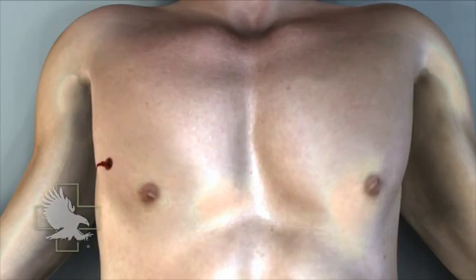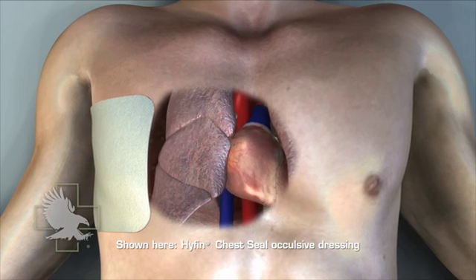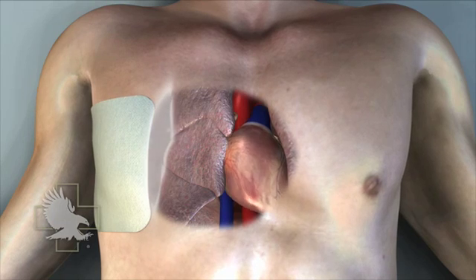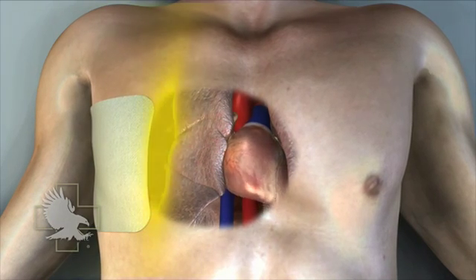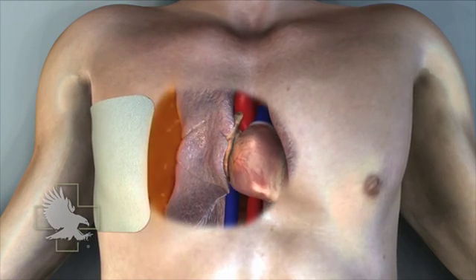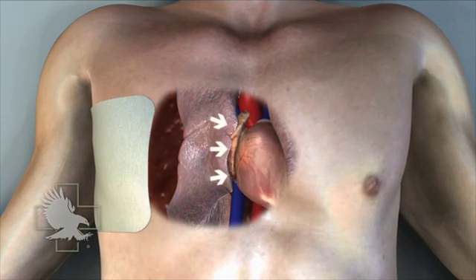This casualty has sustained a penetrating injury to the chest and an occlusive dressing has been applied to stop air from being drawn through the defect in the chest wall. The air pocket — known as a pneumothorax — developed from air that entered the chest cavity through this injury, as well as air that continues to leak from the damaged lung tissue. As air pressure in the pleural space increases, a tension pneumothorax can develop, causing respiratory compromise and shock. This life-threatening condition must be treated before it creates excess pressure that compresses the heart's ability to pump blood effectively.